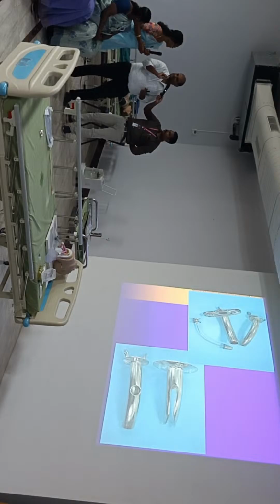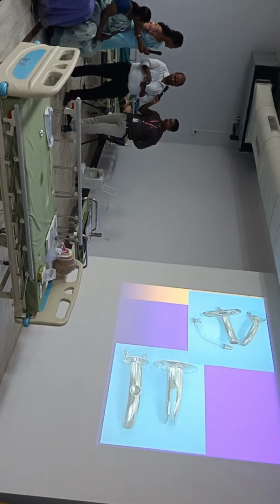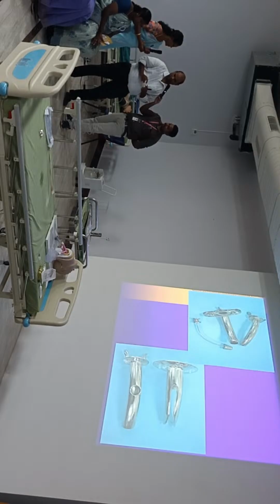Ventilated in the sense you cannot keep the patient on a ventilator or bag him. It's not possible. There is a lot of leak here, and you cannot connect anything here. This can be done only in patients who are awake, planned for discharge, or when you are planning for closure. So you need to know the number and what type of tube. Jackson's we generally don't use nowadays. The Fuller tube is used mainly when you are planning to close the tube.